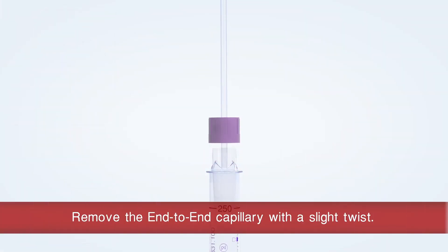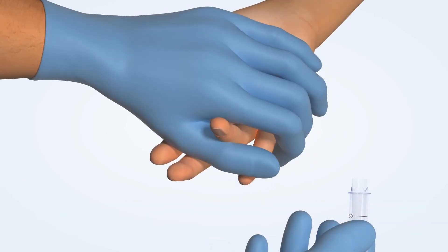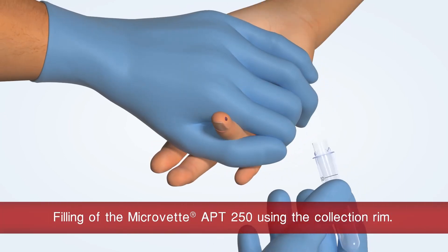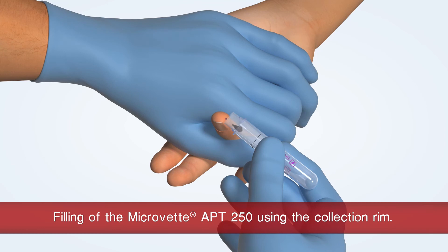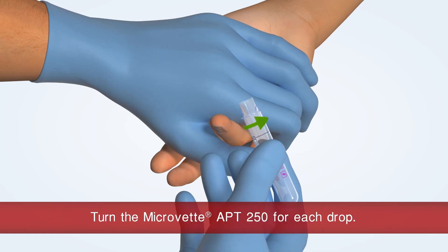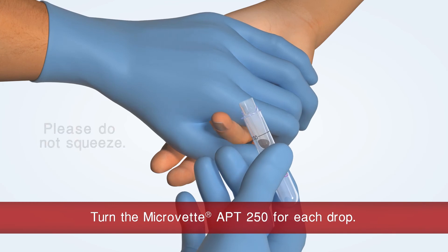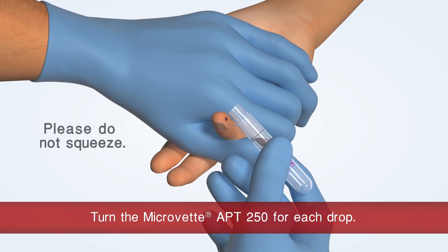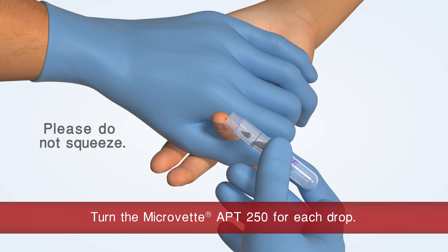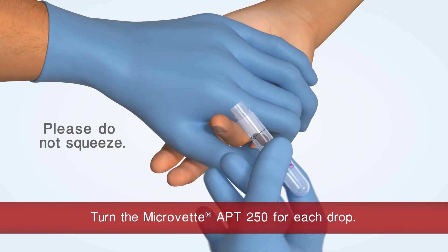Hold the Microvette APT250 and twist off the cap with the end-to-end capillary. Fill the Microvette APT with the help of the collection rim. Make sure that you continue to rotate the Microvette APT after each drop. This ensures good mixing with the preparation and prevents the formation of clots.